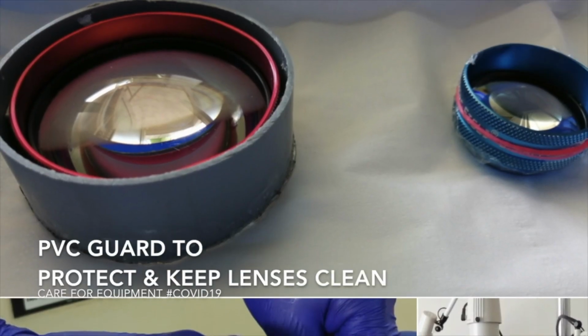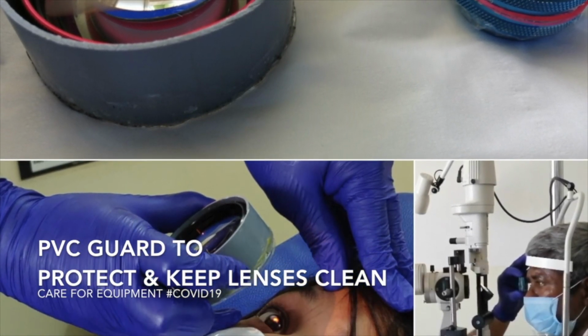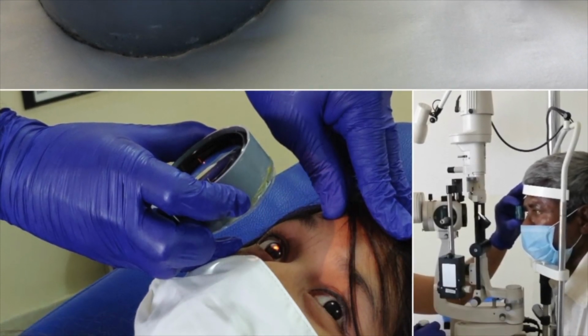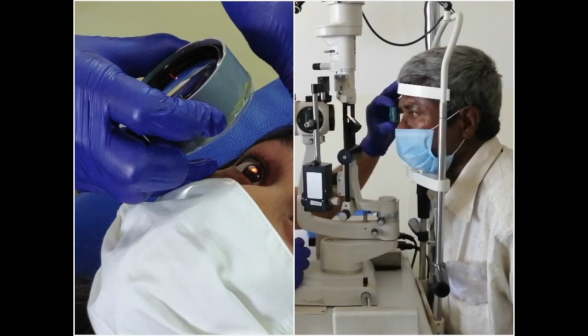This is a short video demonstrating the technique of modifying ophthalmic lenses to prevent contamination, and the safe practices to be followed during IDO and slit lamp biomicroscopy examination. As we can see, while examining, the lenses come in very close proximity to the nose of the patient, hence fomites can settle on the surface and increase the risk of transmission on subsequent examination. Repeated cleaning of the lens is cumbersome and can damage the lens, hence the following modification is useful.